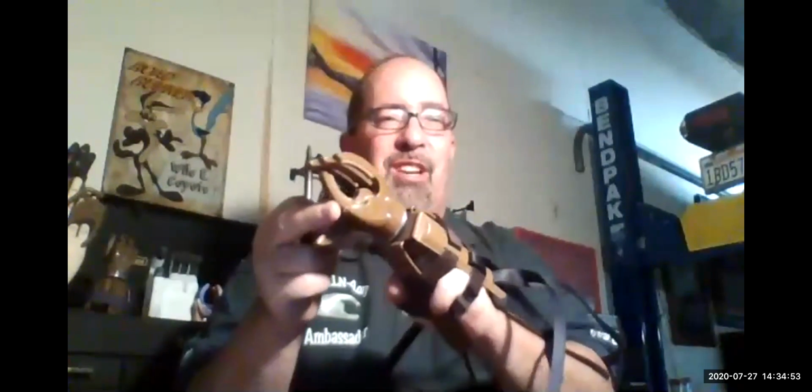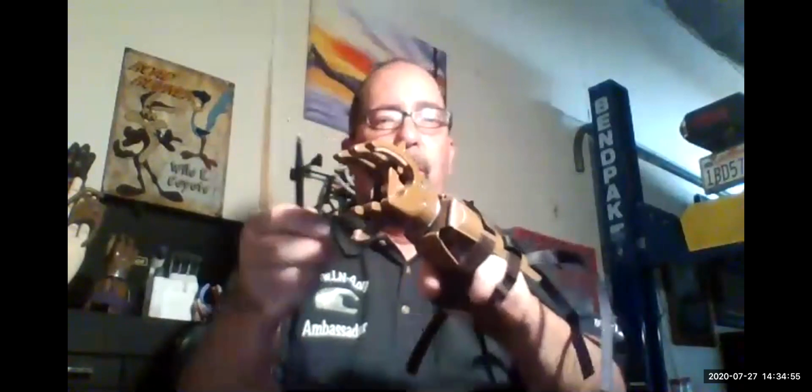The most profound thing that we see is when someone loses the dominant hand. That's why we were doing some of those exercises. And if you close one of the digits and you lay an ink pen in there and you close the other digit, it has quite a grip. And then you can rotate the hand and it's perfect ergonomics for writing.